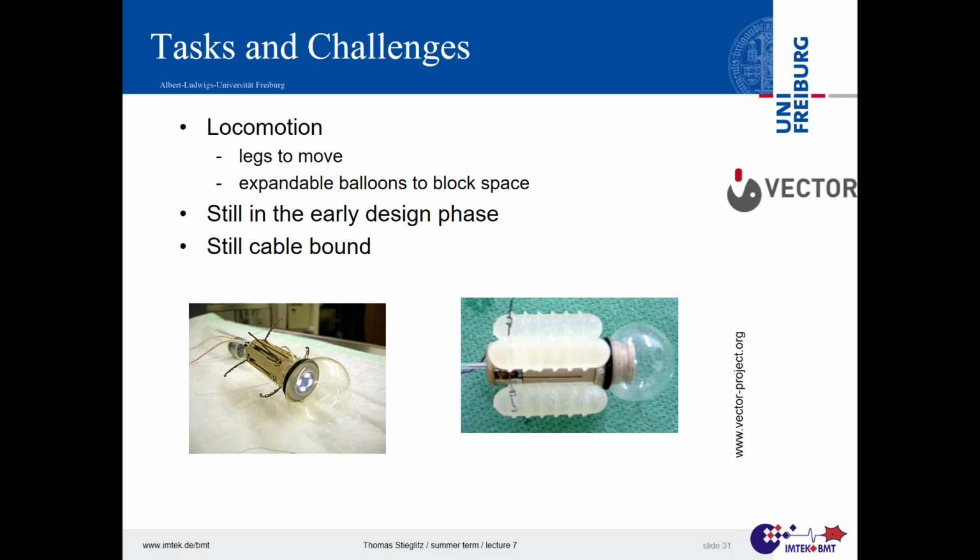Locomotion, that is for me still one of the miracles there. So what people can imagine here is a legged version with, I guess, 8 legs with hooks that you can crawl with. Then if you look at the anatomy, that's quite challenging. The esophagus probably lies at 1 to 2 centimeters. The stomach is much larger. And then comes the small intestine, probably 2 centimeters in diameter. The large intestine, 4 centimeters in diameter. Very flexible, it can expand. So you need legs that are small enough that they can get in line with the capsule so that you can pass, and large enough that you can anchor to whatever wall, like in a boulder championship or something like that, where you get fixed and can hold tight wherever you like. So this is with arms.